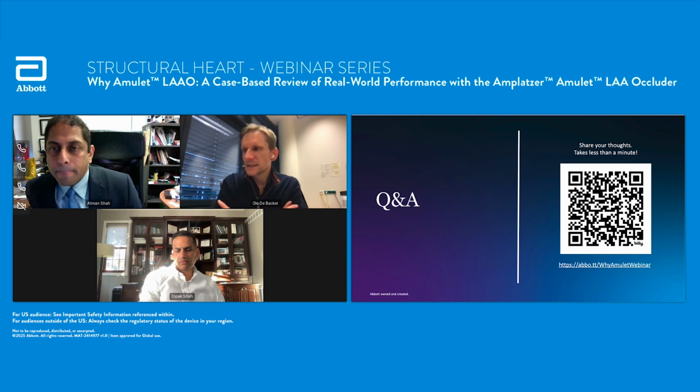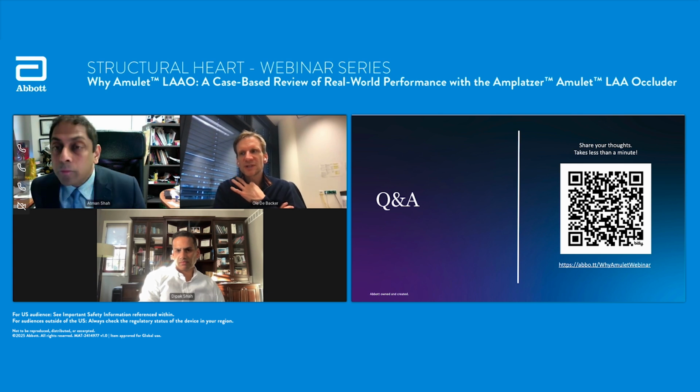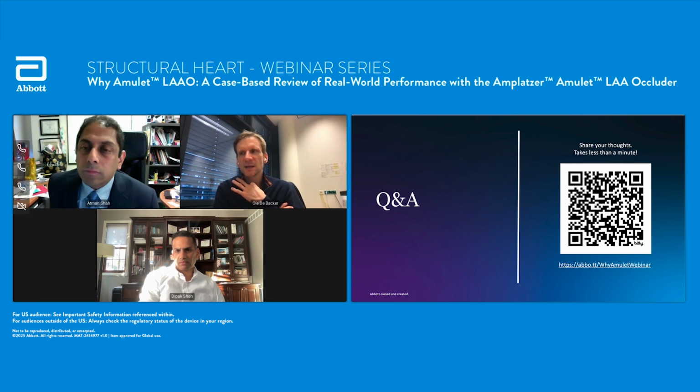Yeah, so first of all, these cases are in local anesthesia with ICE, so these patients go right away after the procedure to the ward. We keep them still one night in the hospital to be monitored, and the morning after they go home. And then 3 months later, we let them come in for a cardiac CT. So that's what I do.